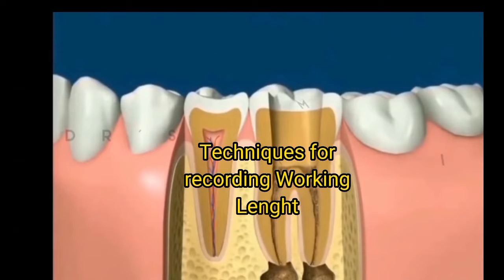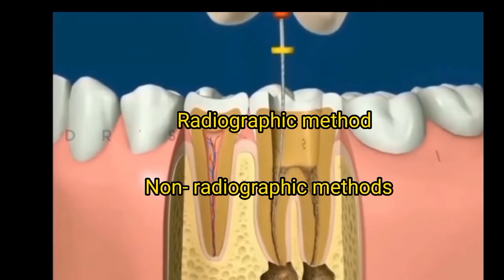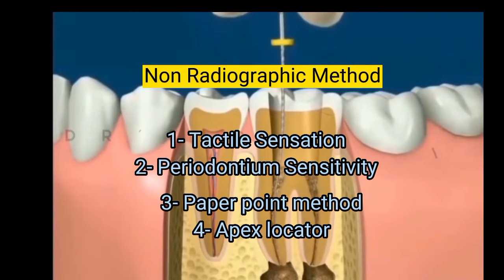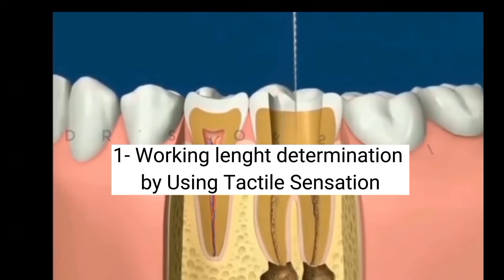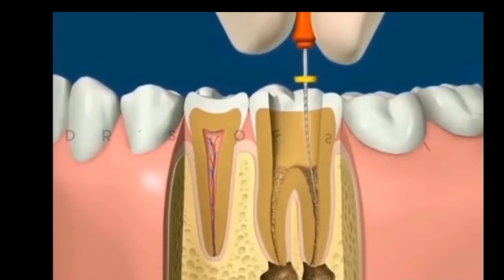Now I will discuss different techniques for recording working length. There are some radiographic techniques and some non-radiographic techniques. The non-radiographic method consists of tactile sensation, periodontium sensitivity, paper point method, and apex locator. The first non-radiographic method of recording working length is tactile sensation.